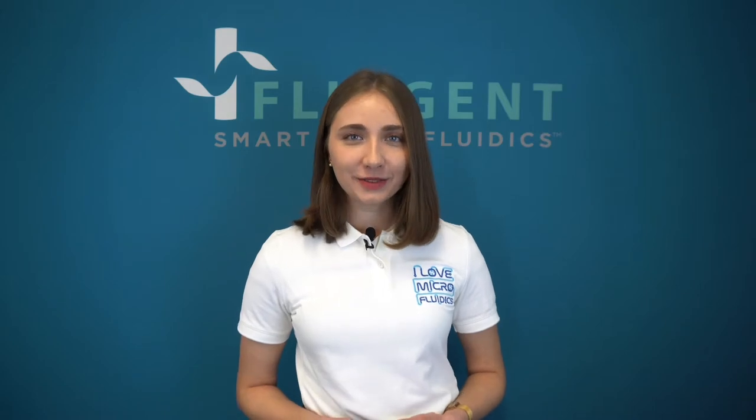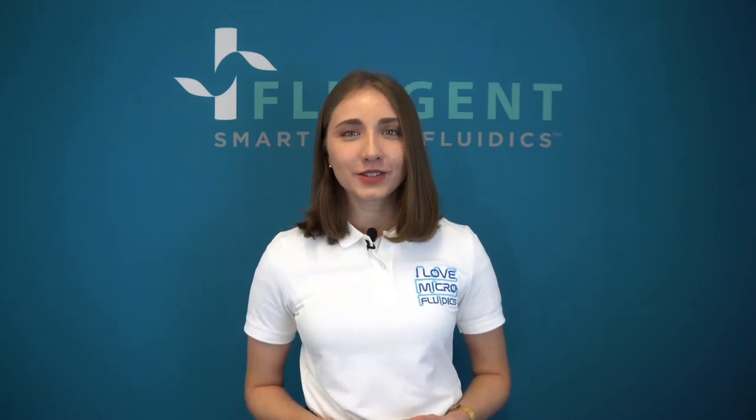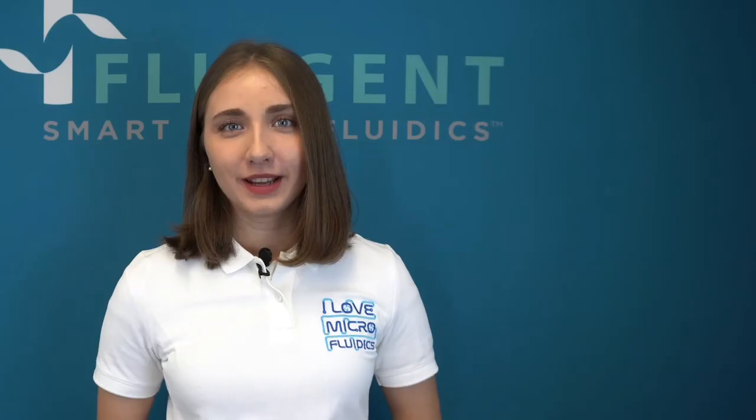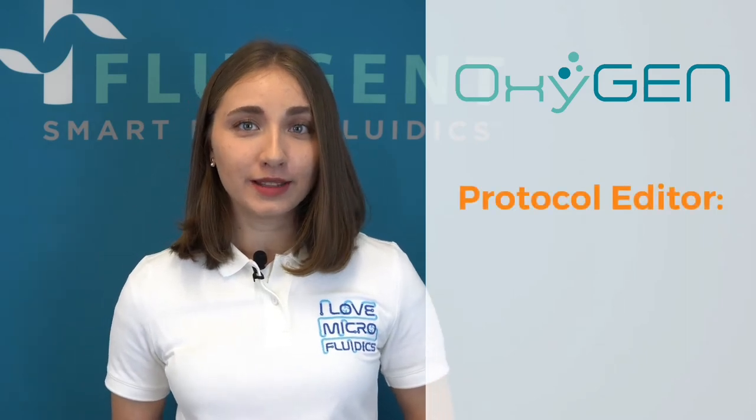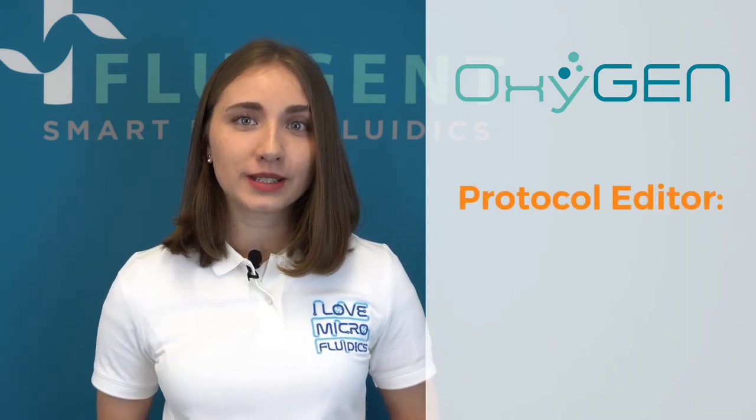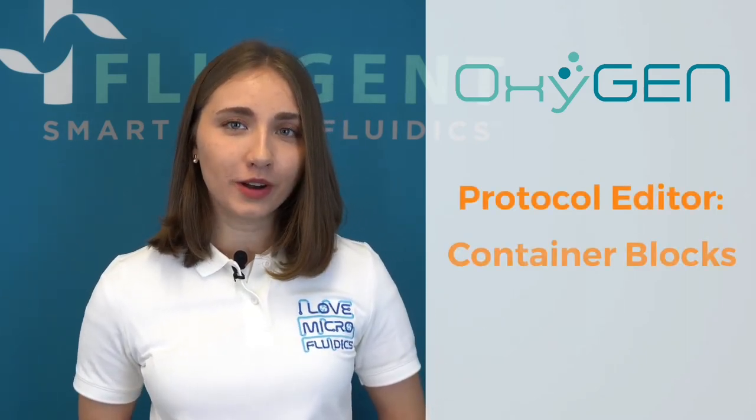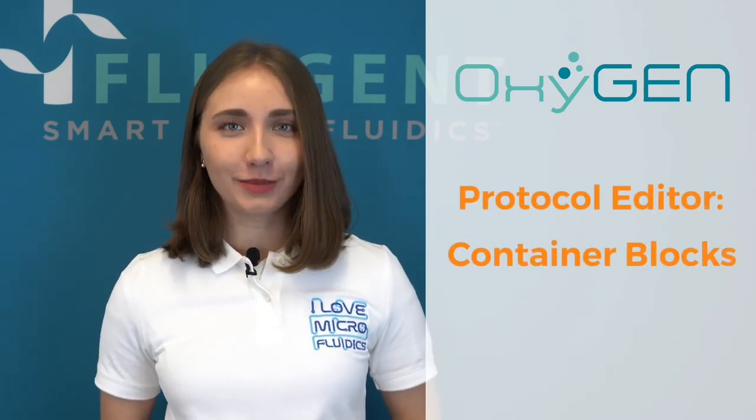Hello, it's Liza from Fluigent. Welcome to another Oxygen video. We'll continue to work with Oxygen protocol editor and this time we'll look at a special type of blocks, the container blocks.